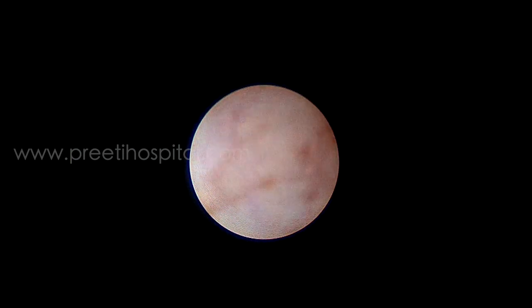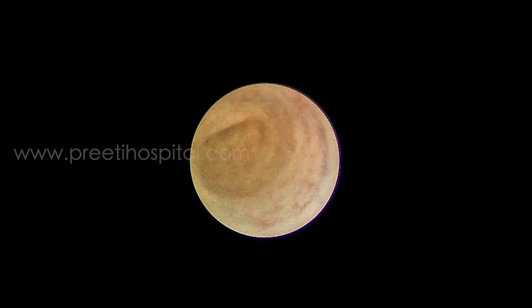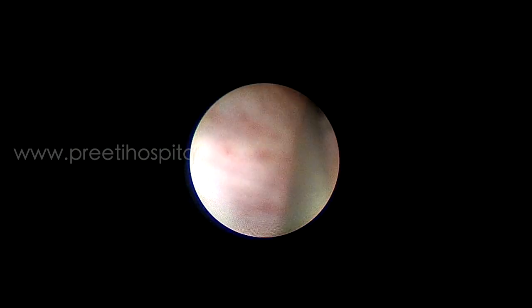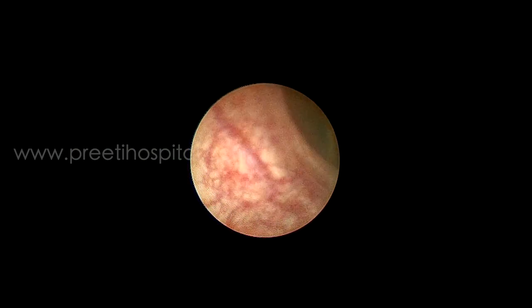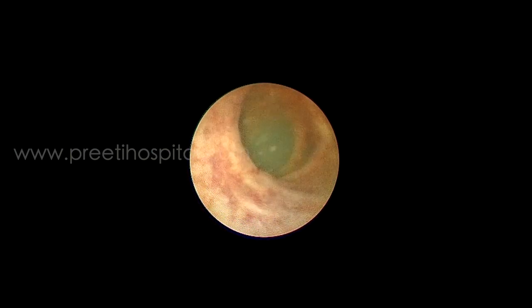Ureteroscopy is done using a 6 by 7.5 French ureteroscope. Since the stone is located in an abnormal position, it is gently migrated to the proximal dilated part of the ureter and the scope is negotiated as proximal as possible with the help of a guide wire. This enables dilatation of the distal ureter, and once reaching the kidney, the outflow is open so that the pressure gets relieved.